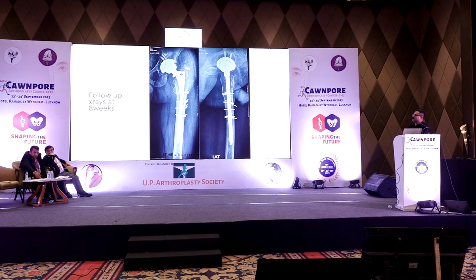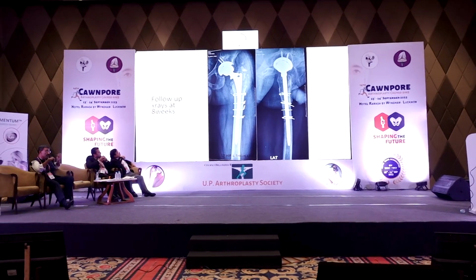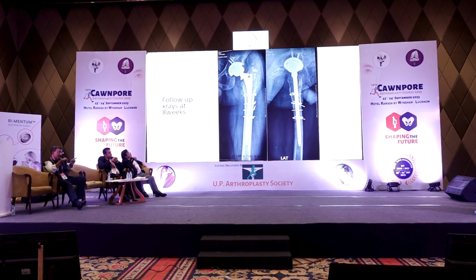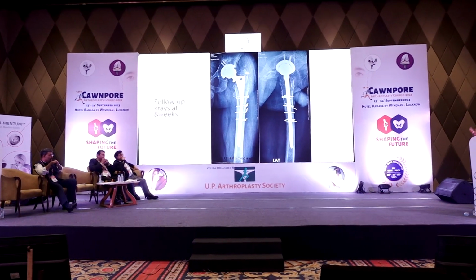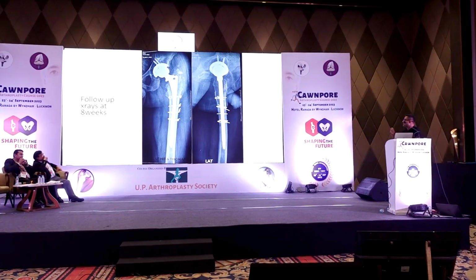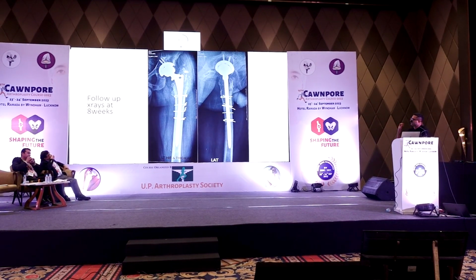Good that you used a solution stem, but what you can do is, especially when you ream to 12, a Wagner 14 also would have fit in, because remember it's a tapered stem. Wagner is a tapered stem. It's not a cylindrical stem. Sir, I had kept it on the table and I was preferring a titanium stem only, but somehow the reamer was not passing. Even the 10.5 was very tight.